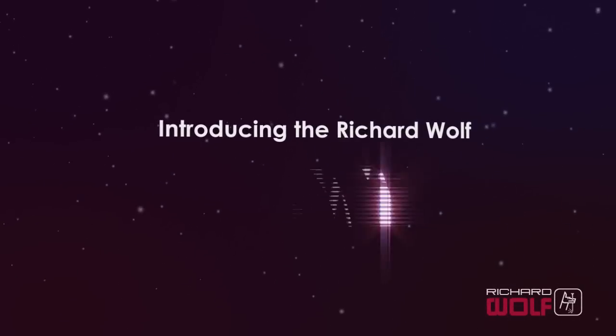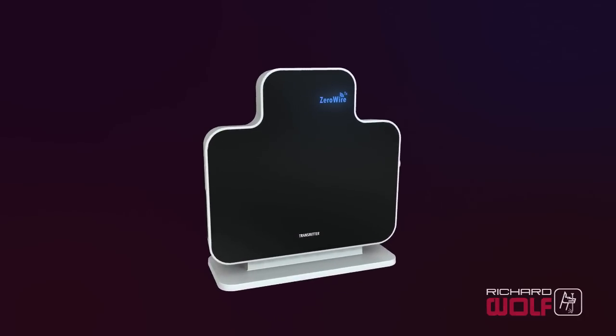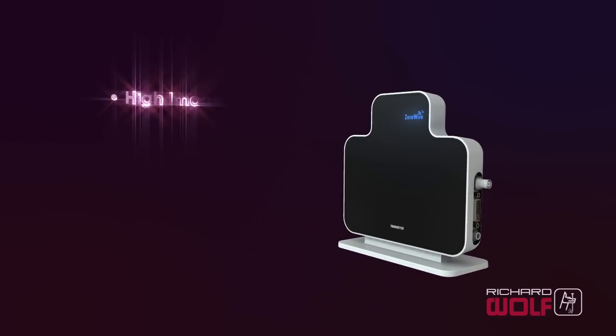Richard Wolff introduces ZeroWire, a wireless HD video solution for integrated OR applications. It is designed and optimized for the OR to provide high image quality.